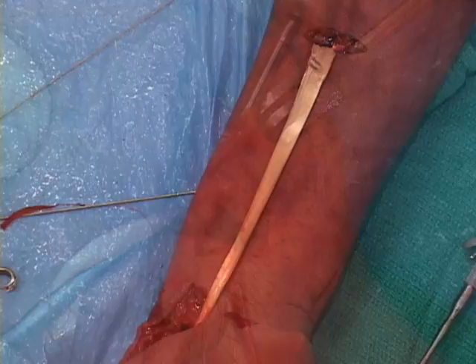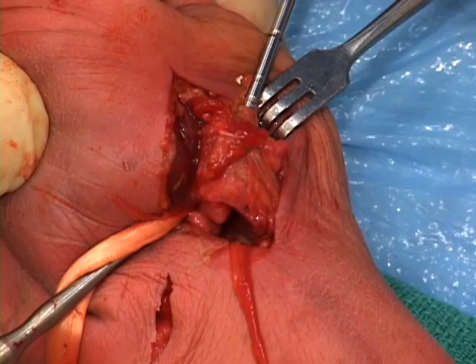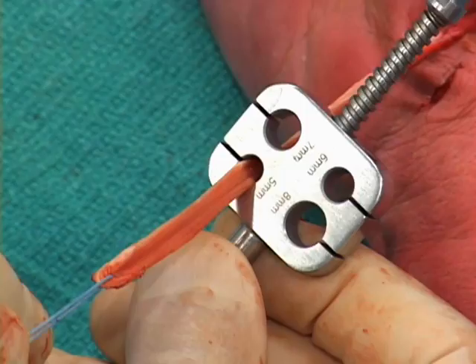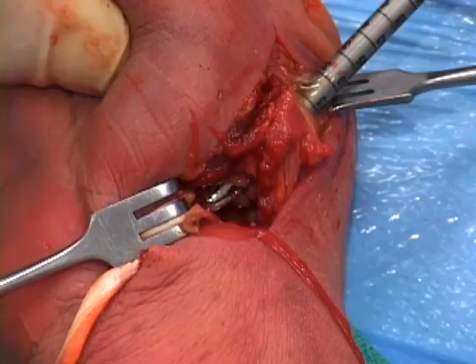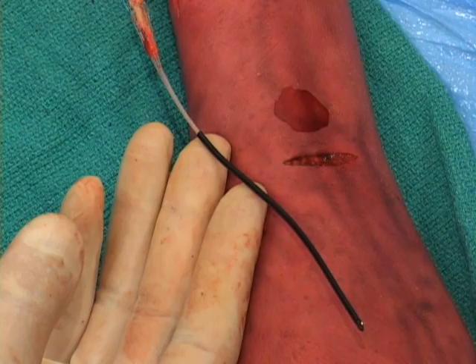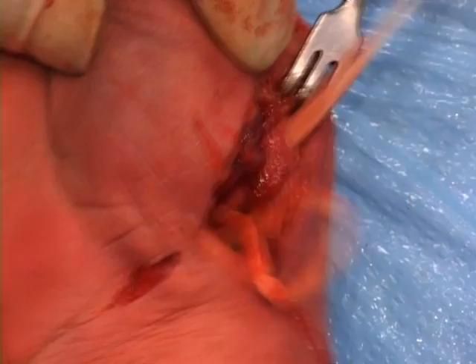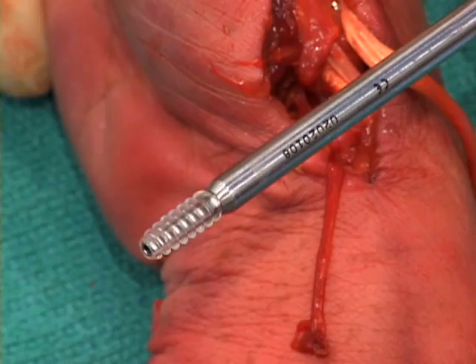Starting approximately 12 millimeters distal from the proximal end of the metacarpal, a 2.4 millimeter guide pin is drilled from dorsal radial to ulnar volar, out the beak of the metacarpal at the articular margin. Care should be taken to avoid the APL attachment with all drilling. The end of the FCR tendon is placed into the white mesh end of a quick-pass tendon shuttle using a pair of pickups. The black nose of the tendon shuttle is brought from the volar beak of the metacarpal out the radial side of the bone, drawing the FCR with it.